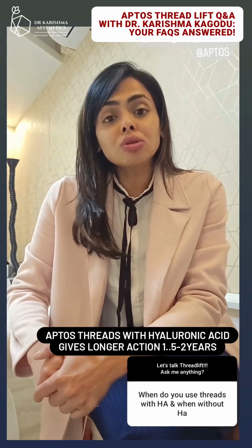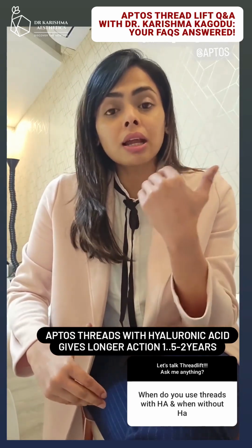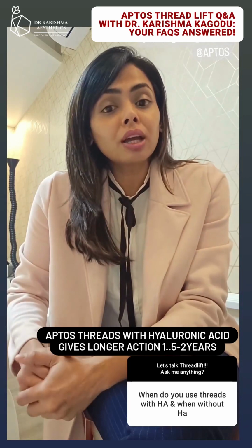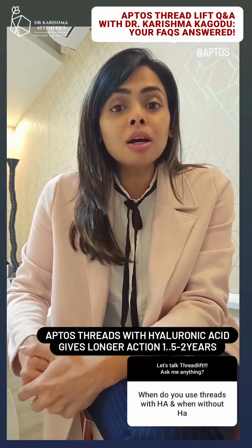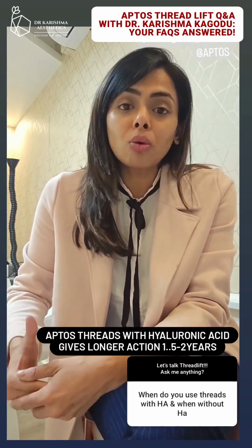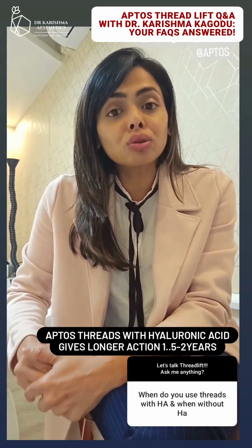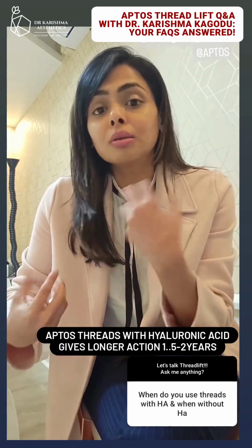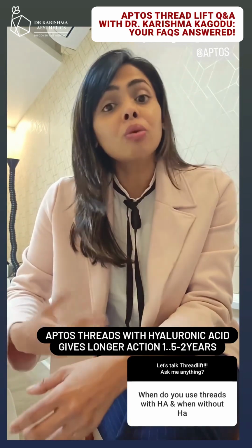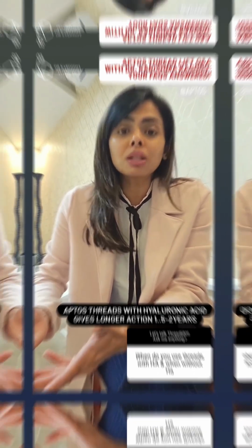Why I would like to use hyaluronic acid in a lot of patients who are looking for a face and neck lift, because as we know, hyaluronic acid is a naturally occurring sugar in the body and it is needed also for improvement in skin quality. So I would choose a thread which contains hyaluronic acid for those where I'm also looking to improve skin quality, skin texture, a little bit of suppleness and hydration, which is seen along with the lift. And those who have a very good skin, I think ones without.